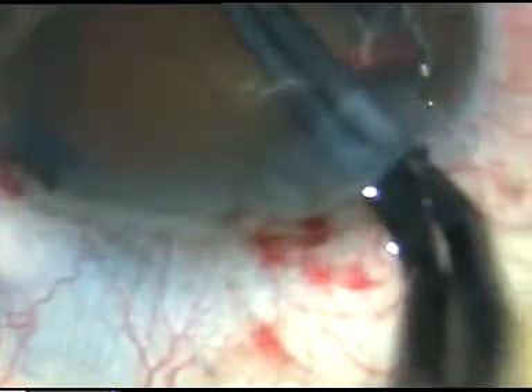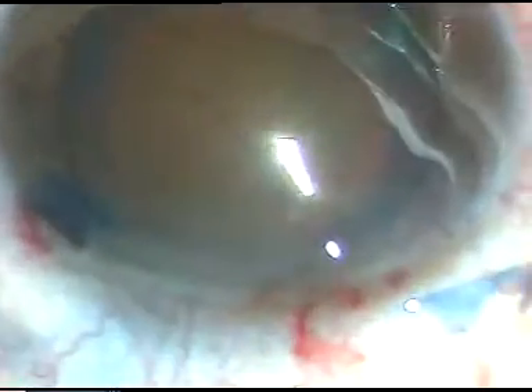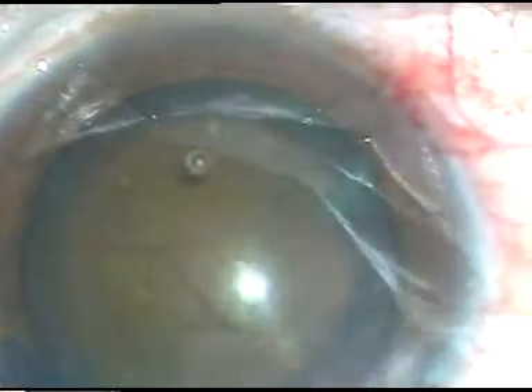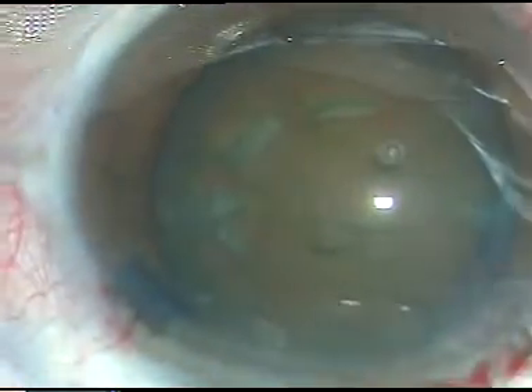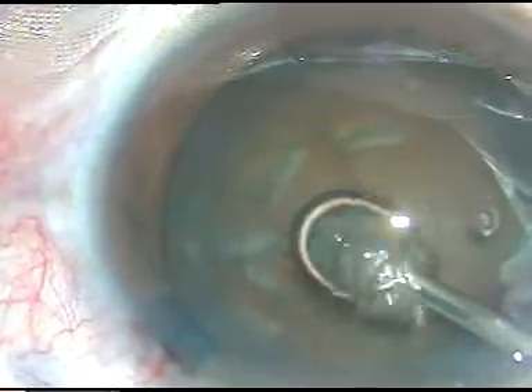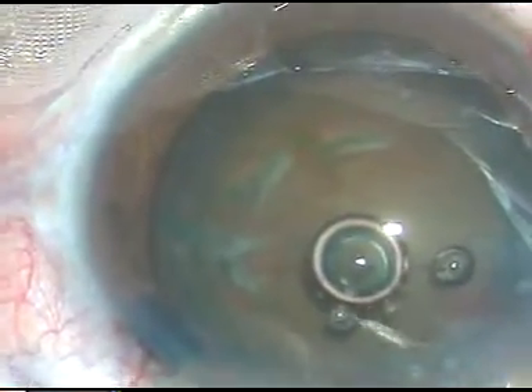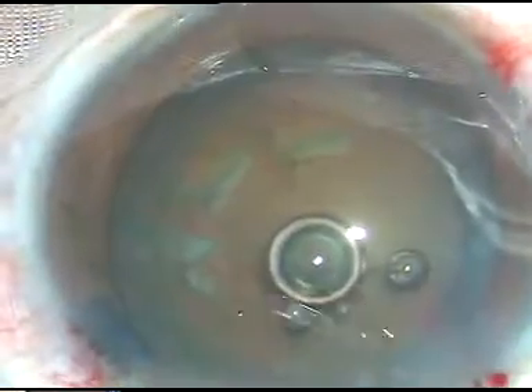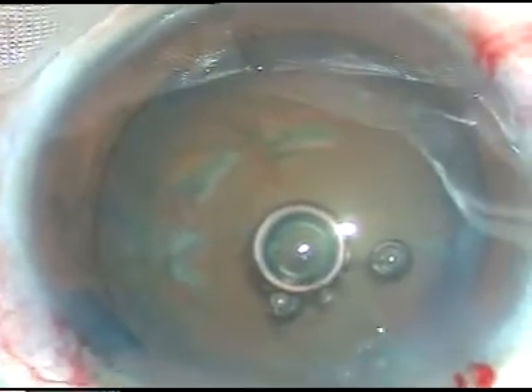This is the first case. The capsulorexis has just now been done. Now hydrodissection is done very carefully. In hard cataracts, we have to do hydrodissection in one or two, sometimes three places. Depress the nucleus gently and rotate the nucleus gently. When the pupil is dilated this much, the case is not very difficult.